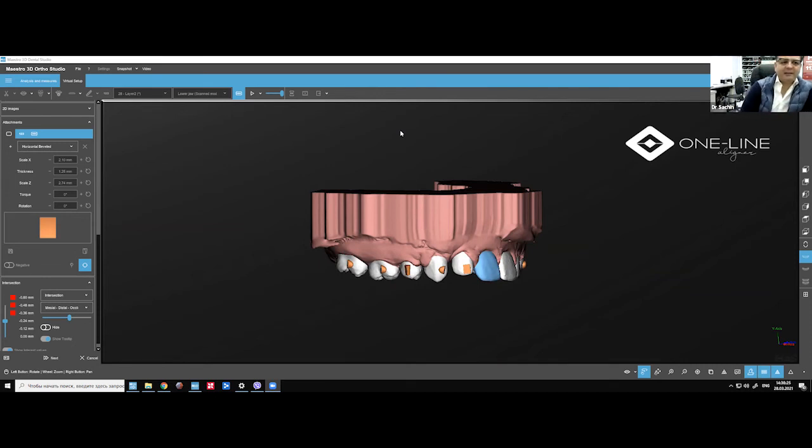But I think, as I said, do the planning first, which is more important, and then plan for the attachment, not the opposite, okay? So that is going to be your basic for today. Plan the movement first and then the attachment. Anybody with any more questions? At the moment, not. Okay.